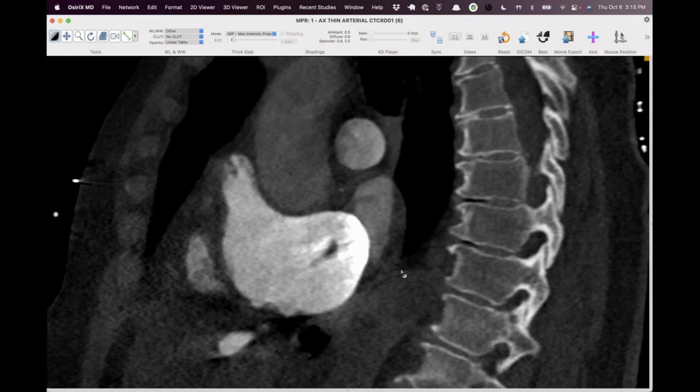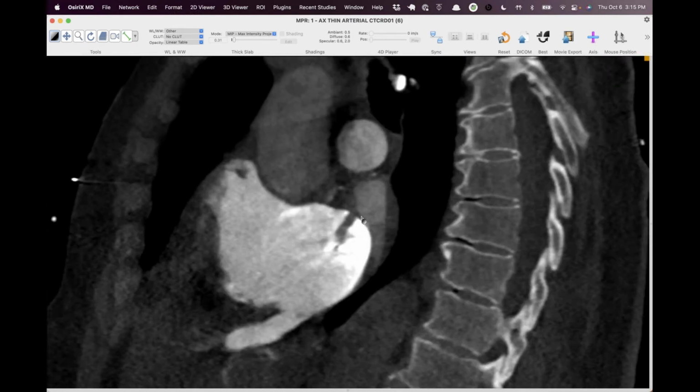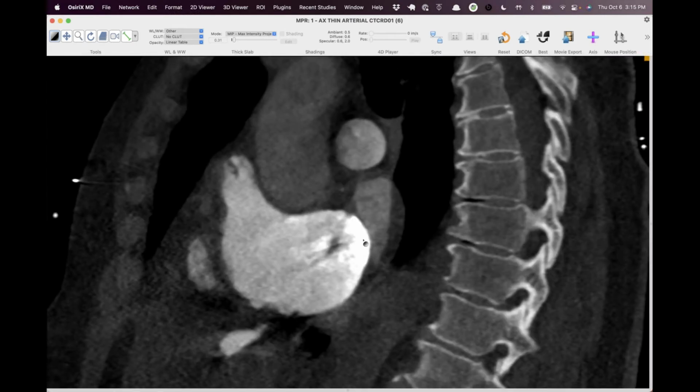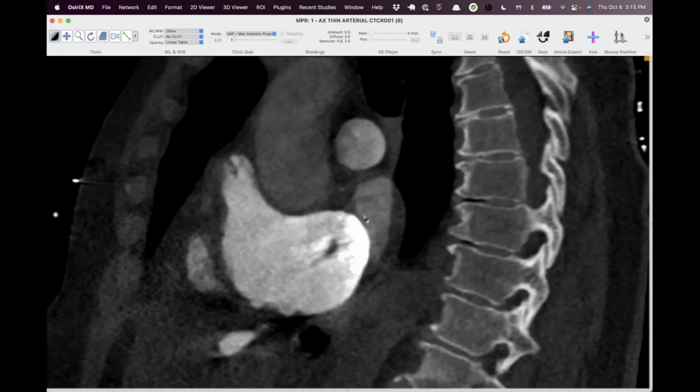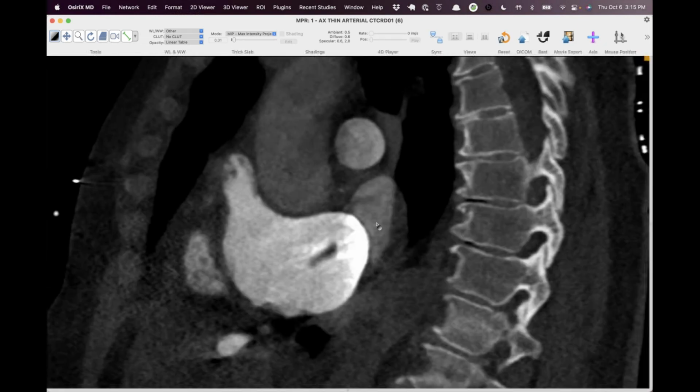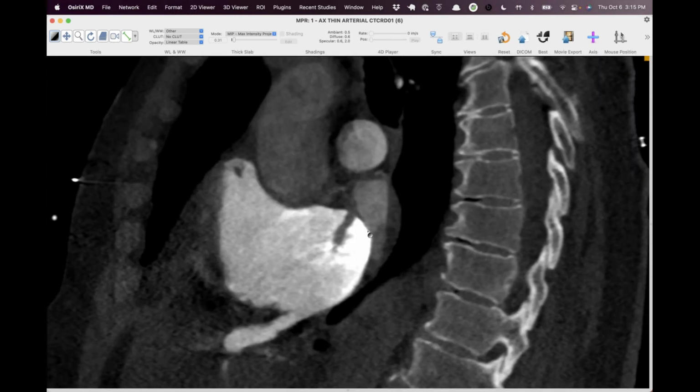You were able to get an image of it. So yeah, it's just essentially stuck there. Right. And I guess you just hope that the whole thing doesn't throw off, or that you don't get a showering of emboli to the systemic circulation. But obviously, patients with PEs do present with systemic emboli, paradoxical emboli, and usually we don't catch this, but this is what that is in motion. Mm-hmm.